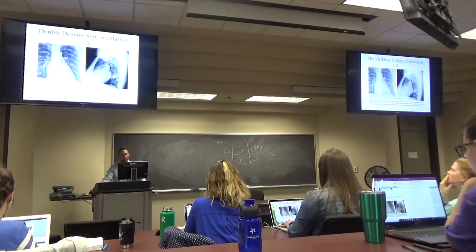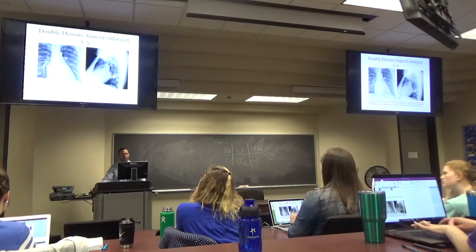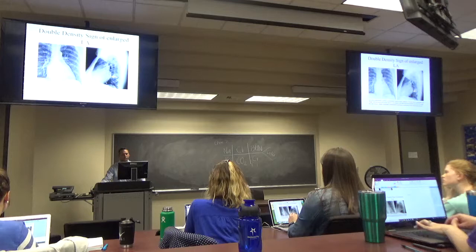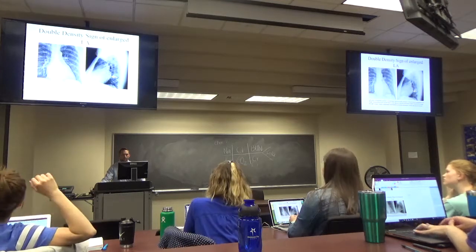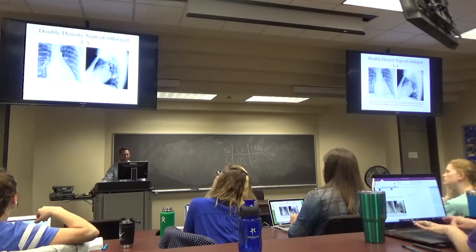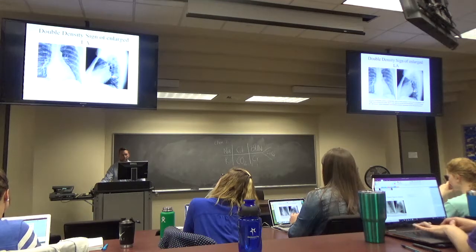And you can tell when you look on the lateral x-ray that you have this posterior enlargement right here of the heart. This is supposed to be kind of straight down. You're supposed to have a nice window in between your spine. You're supposed to be able to see clean lines of the trachea, but there's really nothing back here. It's totally obliterated by this enlarged left atrium.